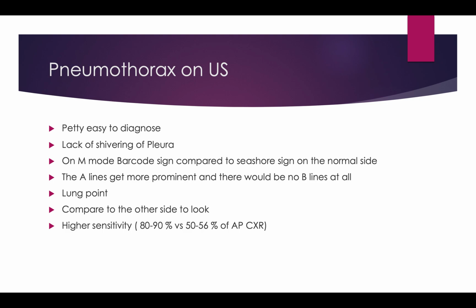Always compare with the other side. Don't forget. And one thing to mention is there are many studies about this that show that in the hands of an expert, lung ultrasound can be up to 90% sensitive, compared to 50% for your trauma patients who are lying supine in the resus room that you do an AP chest x-ray on. Quite valuable. Thanks.